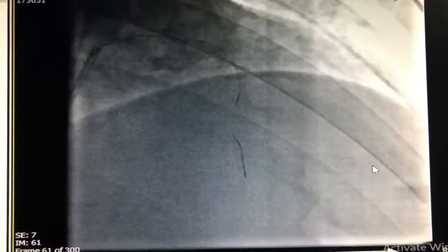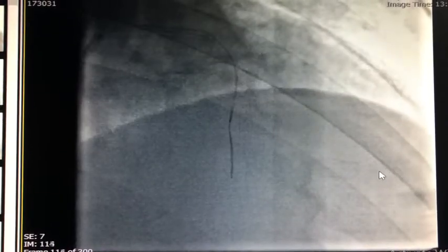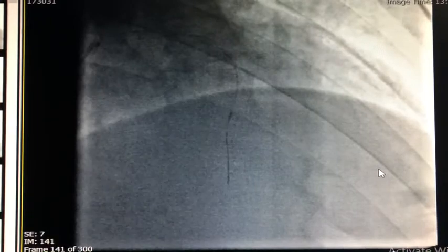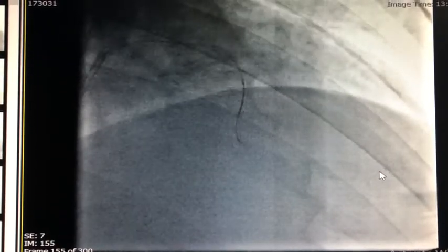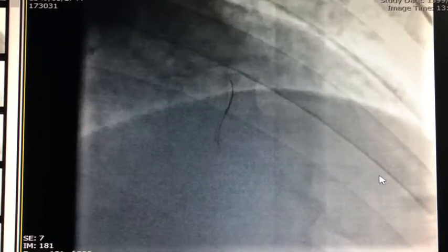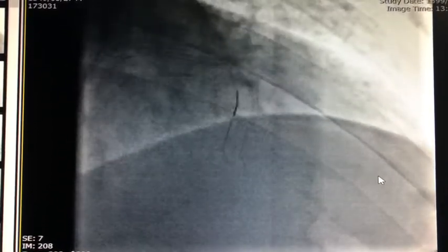As you can see in the passage, there are a couple of very important points in manipulating the SUOH 03. First, you have to just rotate it and let it slide with each contraction of the heart by itself. There should be no pushing, and then you have to pull back and redirect, and then wait for the wire to pass.